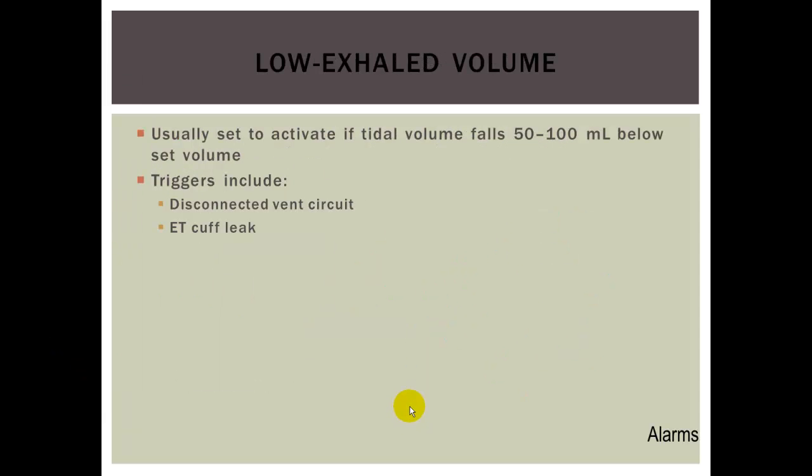Low exhaled volume, usually set to activate if the tidal volume falls 50 to 100 milliliters below the set volume. Triggers include disconnection of the vent circuit, or an ET cuff leak, where instead of ventilating the patient, it's ventilating the oropharynx.